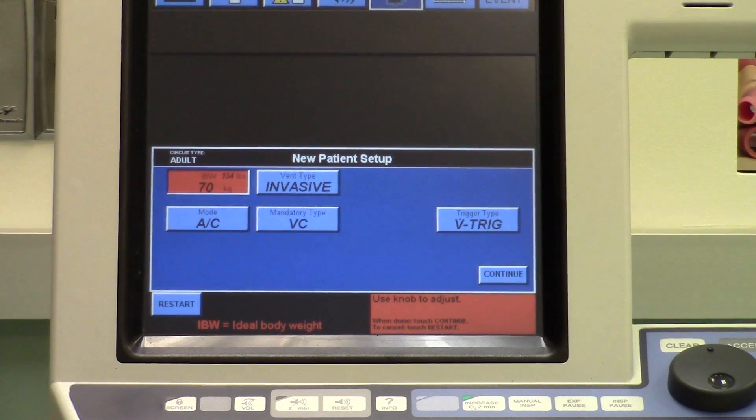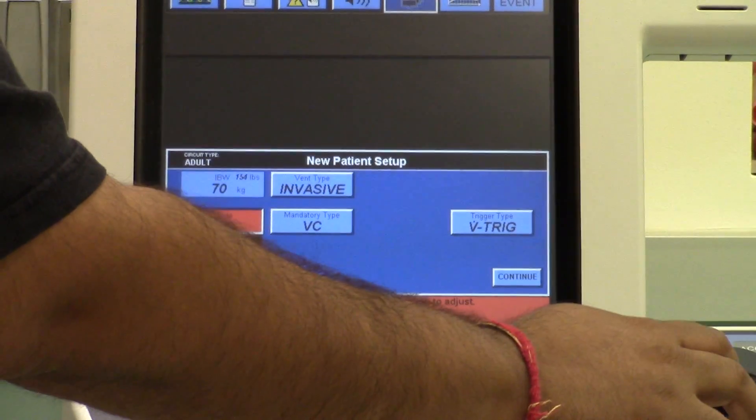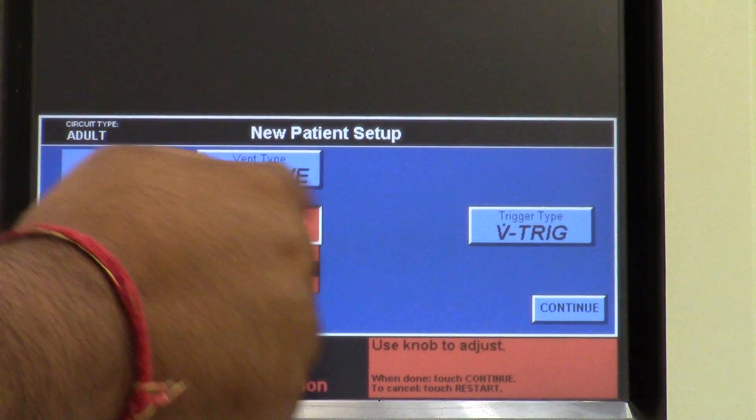You will notice the bottom portion of the ventilator screen is labeled new patient setup. Select the choices as outlined. For mode, touch this and you will see four different selections — set the mode to AC mode. For mandatory type, press this and you will see three selections.